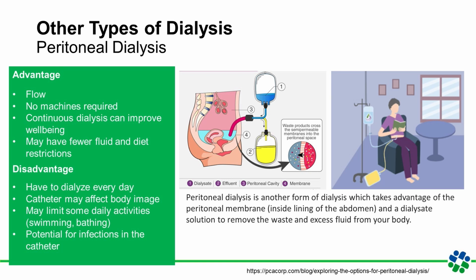However, peritoneal dialysis does come with its own set of challenges, as do all forms of access. Dialysis needs to be done every day, which may be more time-consuming. The catheter can affect body image, and you may need to make some adjustments in your daily activities, particularly water-based ones, again, like swimming and bathing. And there's also a potential risk of infection from the catheter site. Like all treatments, it's about balancing the advantages and the disadvantages. And more importantly, it's about what works best for you and your lifestyle.